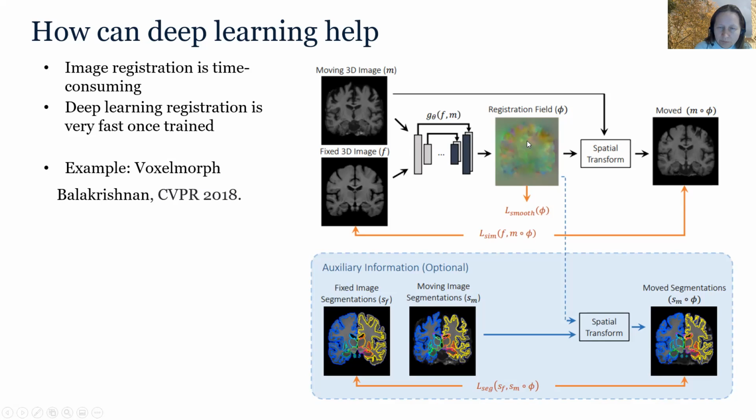This deformation field can then be applied to the labels from the atlas, so the labels are warped to the space of the fixed image, which is our new image, and that way we obtain the propagated labels. It will be very quick, and we can do it with multiple atlases as well in a very short time.